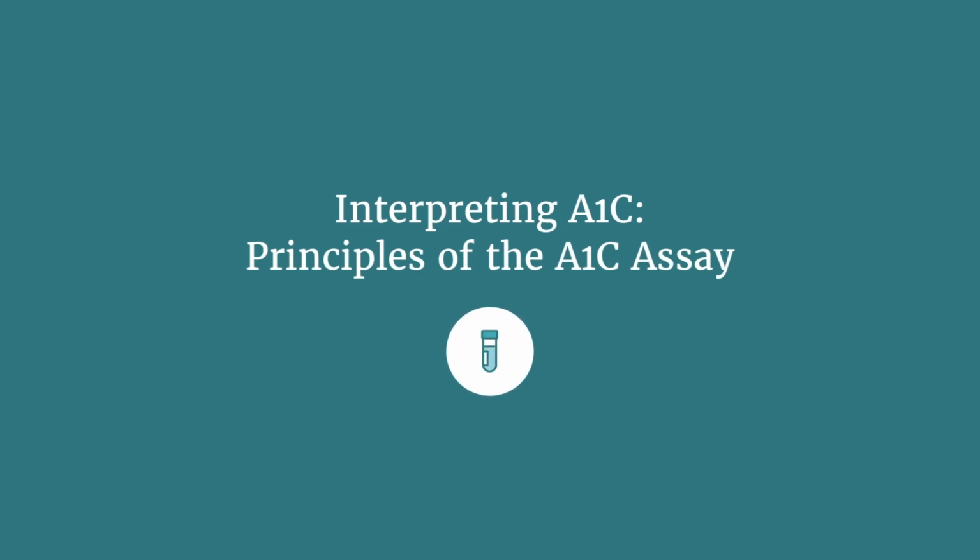Hemoglobin A1C, which is also called A1C, is hemoglobin with glucose attached to the N-terminal valine of the beta chain. Because red blood cells, which contain the hemoglobin, live for approximately 120 days, hemoglobin A1C reflects the average glucose over the preceding 8 to 12 weeks.